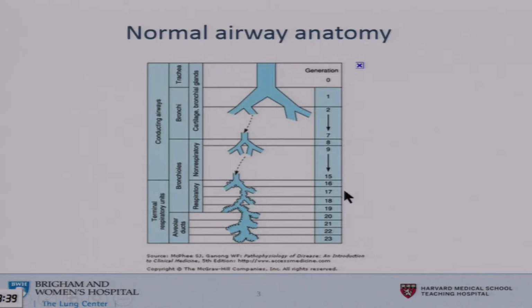And as we move down more distally into the airway anatomy, you see that the airways become more dilated, and they have these sacs attached to them which give them more surface area. And this becomes relevant as we talk about quantitative CT imaging, because these areas are going to be how we designate the quantitation that we use to actually create the scan.